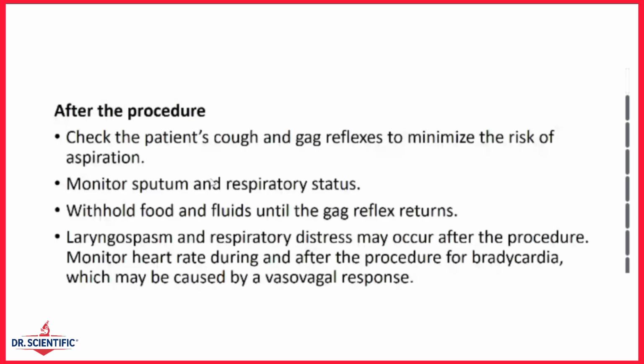Monitor the sputum and the respiratory status of the patient frequently, because in the process of doing that procedure, there could be irritation of the airway lining. So monitor the sputum for any form of bleeding. Respiratory distress can occur, so monitor the vital signs of your patient.